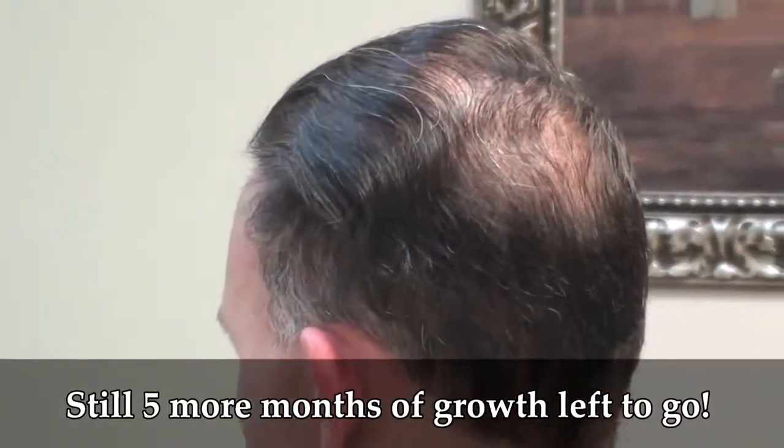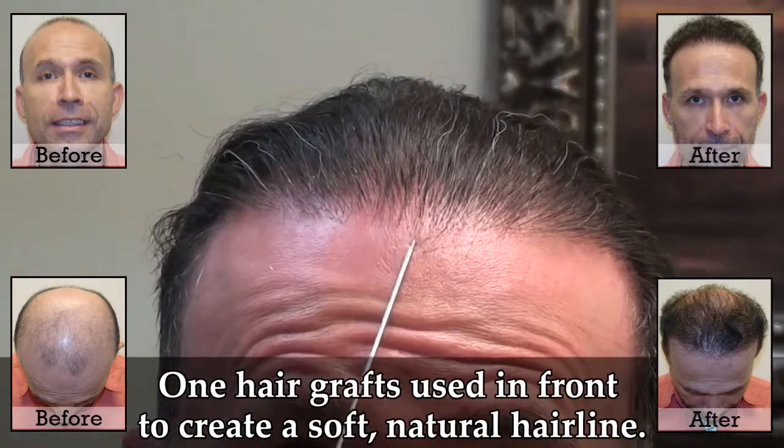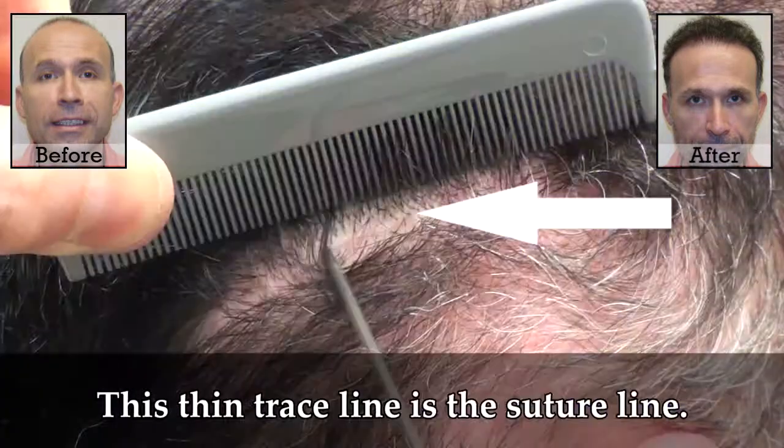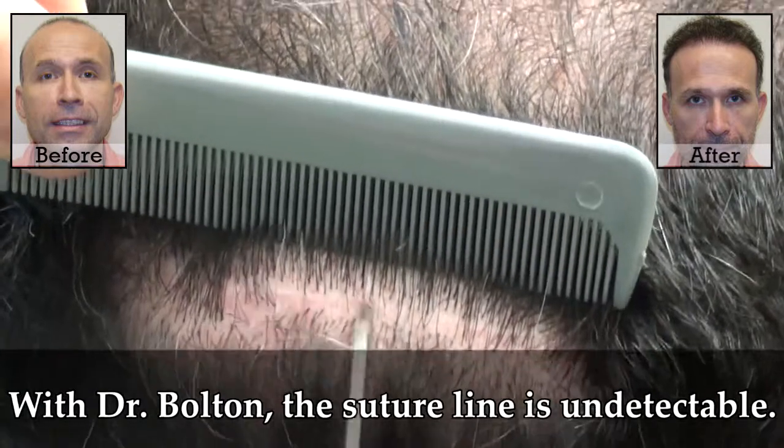Two procedures right now and the second one's not even fully grown in yet. We used little one-hair grafts all the way around his crown as well. This little line that you're seeing here — that's the suture line right there. It's a fine, thin little trace line.